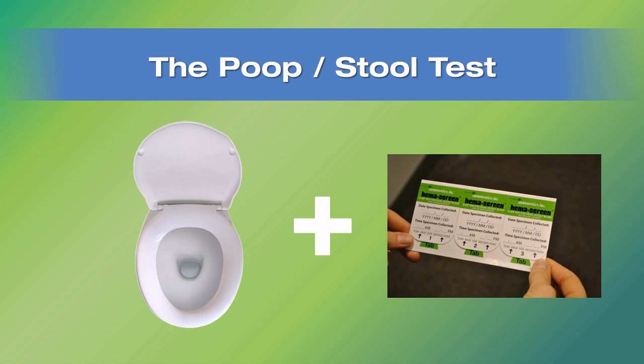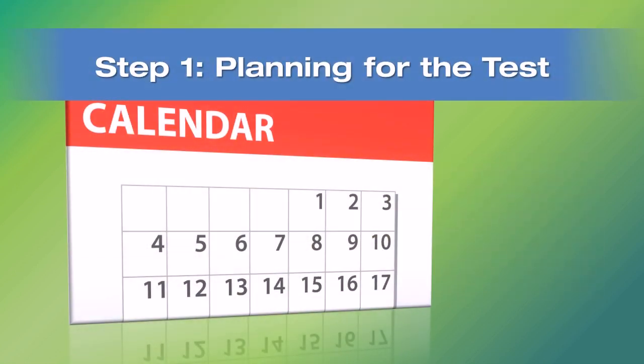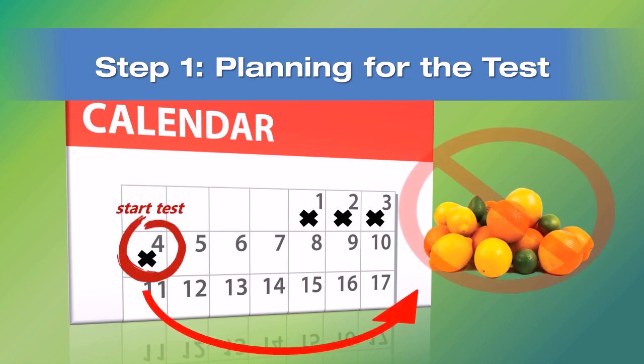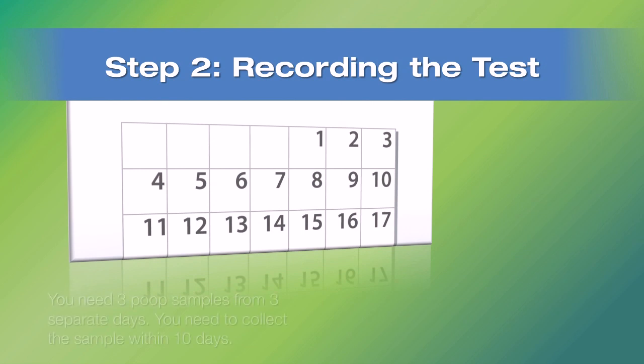To do this test, you need a kit from your doctor, and then you need to collect some of your poop when you're at home and you mail it into the lab. The first step is to plan for the kit. 3 days before the test and during the test, do not eat any citrus fruit or juice. This includes vitamin C supplements. You will be testing 3 different poop specimens on 3 different days. You will be collecting 2 samples from each of these 3 poop specimens.